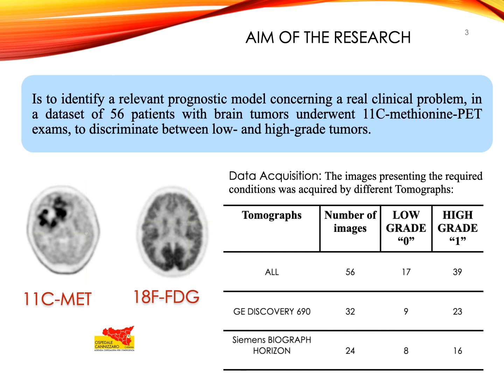For this reason, we investigate the diagnostic power of methionine, which is an amino acid involved in protein synthesis and is modified in tumor cells. It's selectively captured in the tumor region, making tumor identification easier. The histological information is useful from a clinical point of view because it influences the patient management and the prediction of the biological behavior of a tumor.